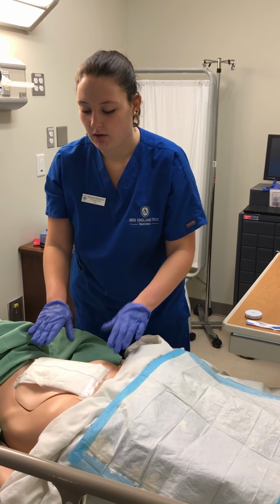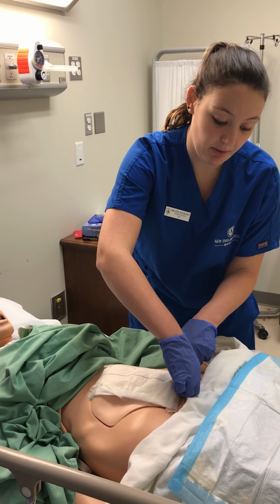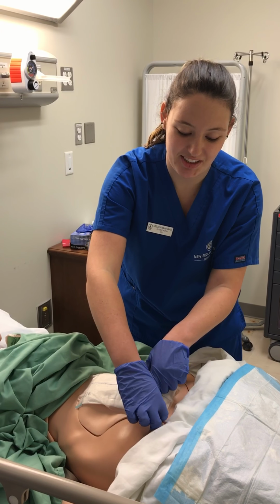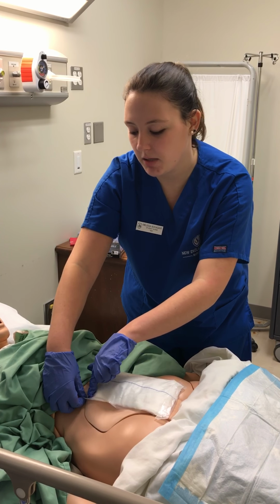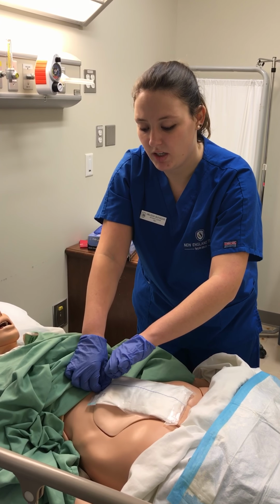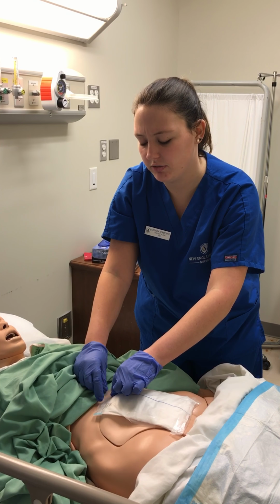Okay. Now I'm going to remove the ABD pad. I'm going to do this by pressing down while pulling up on the tape on the edges. This is to help prevent further tearing of the patient's skin. And if the tape is being stubborn, just get an alcohol swab and moisten the tape and it should come up easier. Just want to be careful that you don't hurt the patient further.